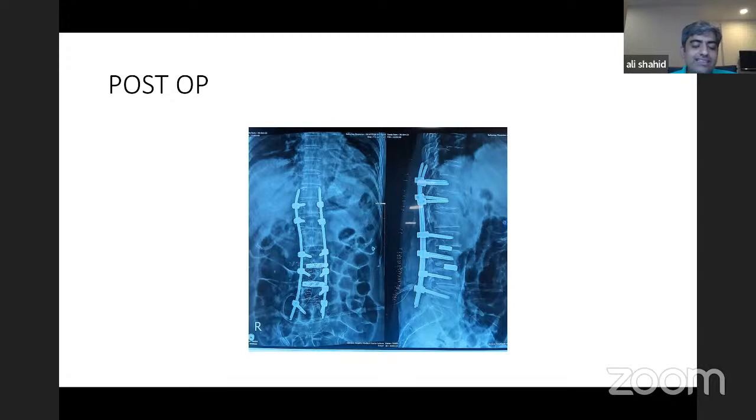So I think as far as the lordosis is concerned, anterior opening up of the disc or the contouring of the rod is the best thing we can do. As far as the pelvic incidence, yes, we can calculate it after the surgery. But during the surgery, with this 5.5 system, it was not able to correct the lordosis to the expected level.